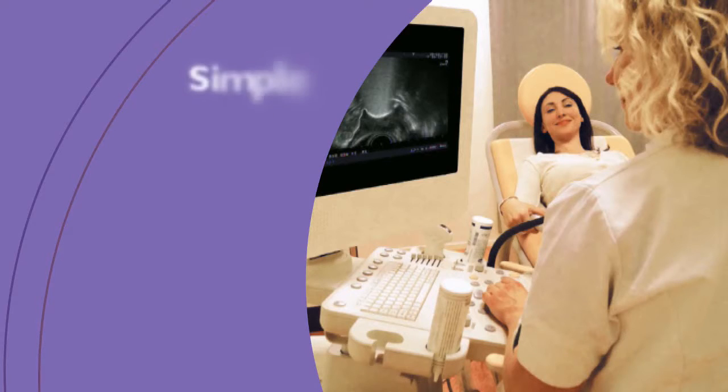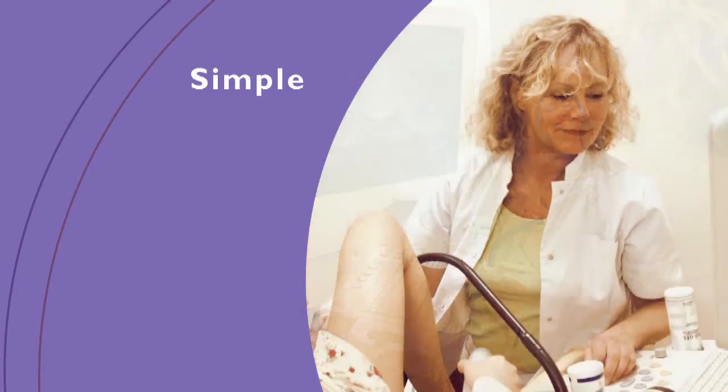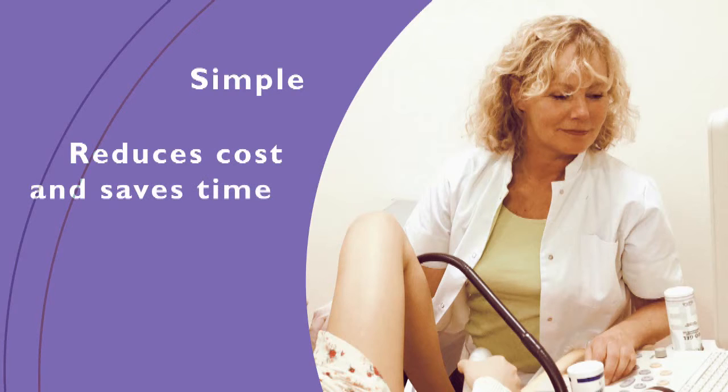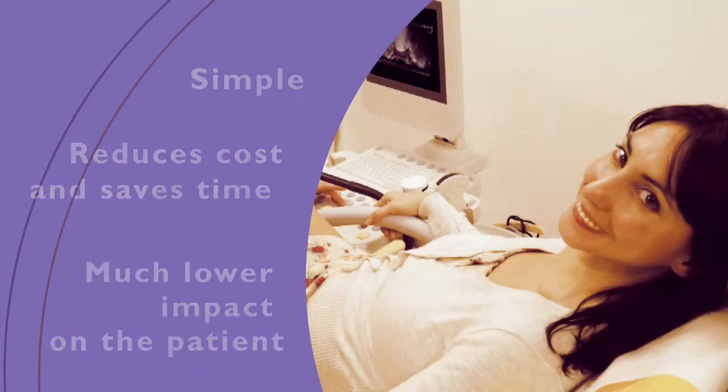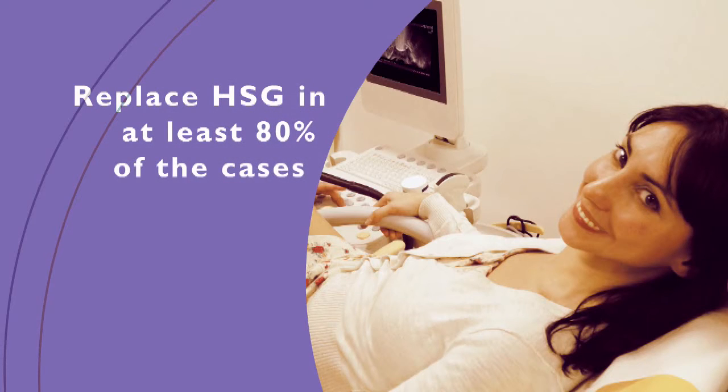The advantages for doctor and patient are clear. Patients can now be examined at the familiar outpatient gynecology clinic. Neither the gynecologist nor the patient have to go to radiology, saving time and money. Moreover, this examination is very patient-friendly and causes relatively little discomfort. This new method can replace painful HSG in at least 80% of the cases.